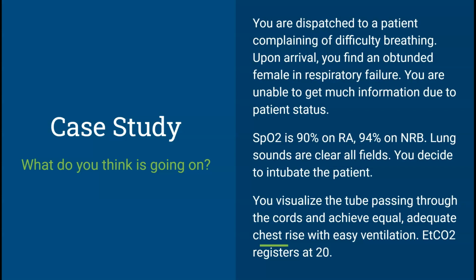This is where I'm not seeing a waveform, which might give me some indication. Okay, but think it through, right? You've got good lung sounds, and your end tidal is 20. So her lungs are clear, but I'm gonna say internal.